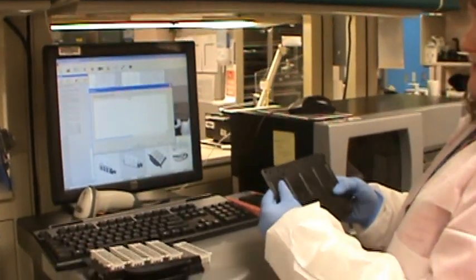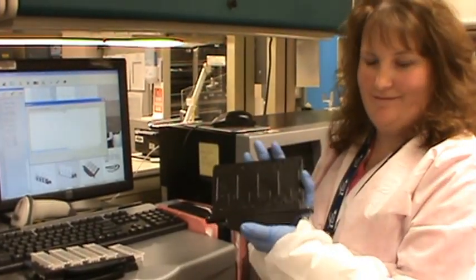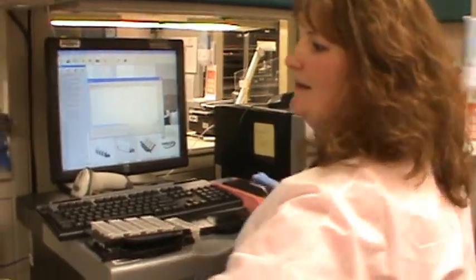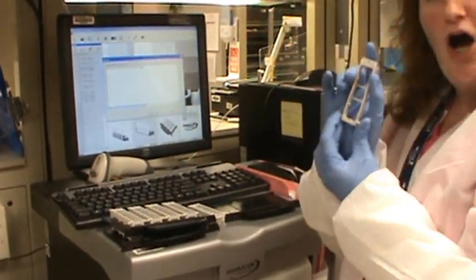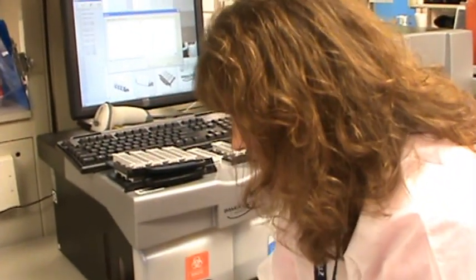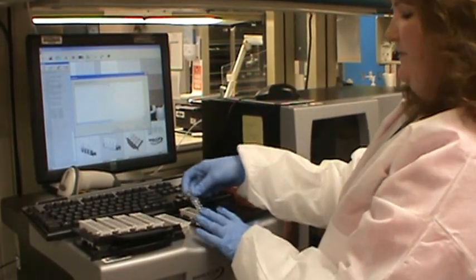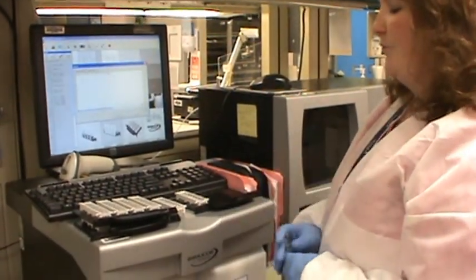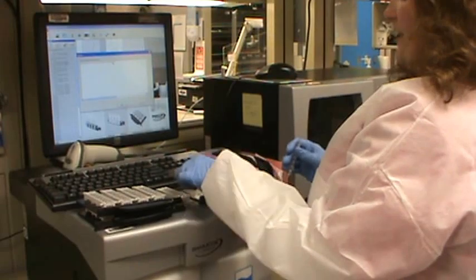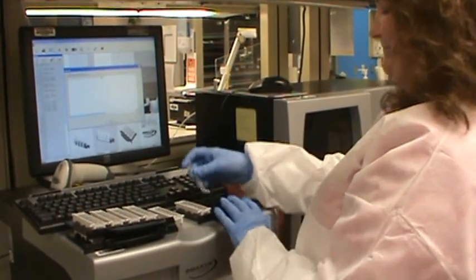This is a micro-well strip holder. I will have my CMT micro-well strip, and since I'm only running one sample, my holder needs to be balanced, so I will put a balance strip.